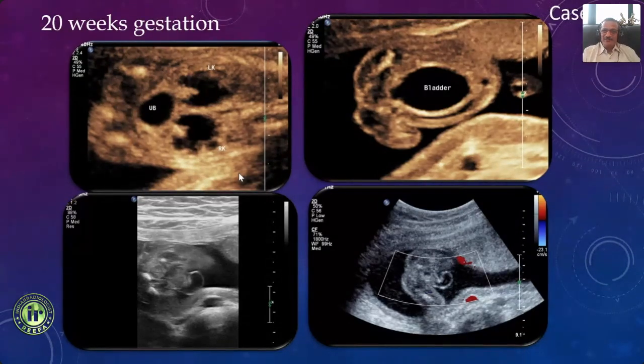So what are we seeing here? We are obviously seeing dilated kidneys, a bladder, and this posterior urethra dilated. But is that the end? Are we seeing something more beyond that? And that thing doesn't show color, and that thing we are not supposed to see. So I think enough clues, Sanjeev. Yeah, we've got the answer, sir.